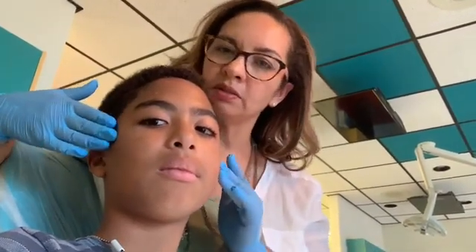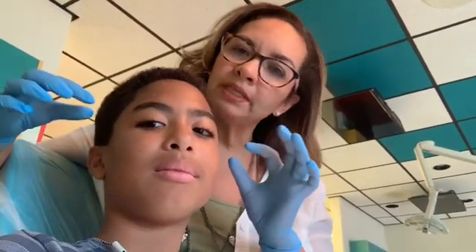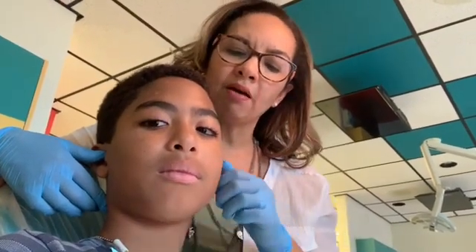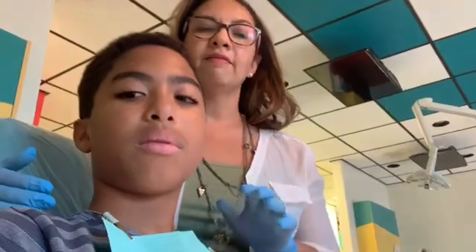How we protect from a concussion is: the lower jaw's condyle matches up with the base of the skull — open and close your mouth. The mouth guard opens up the bite to absorb shock waves if he gets impacted from below the chin, because all that force goes up, hits the skull, and can shake the brain causing a concussion. So that extra cushion helps prevent concussion, which is why you'd want to protect your athlete.